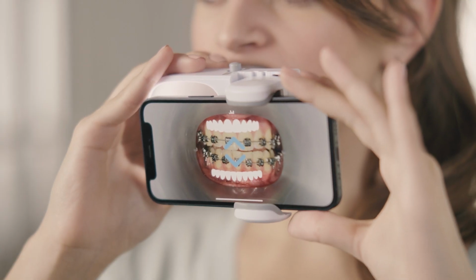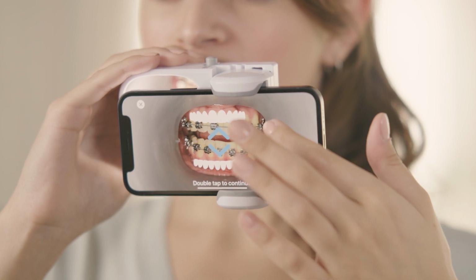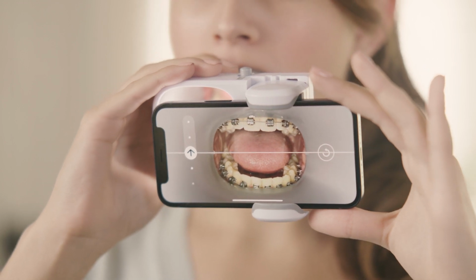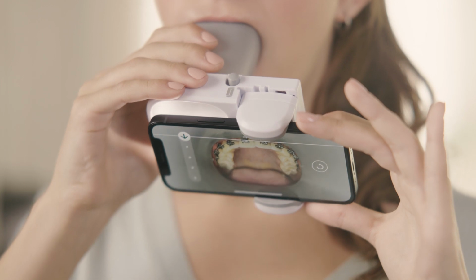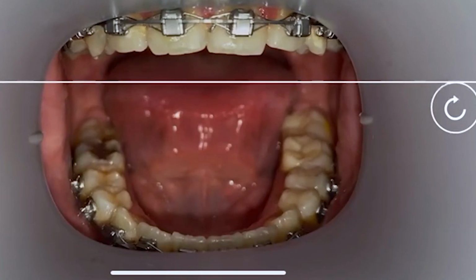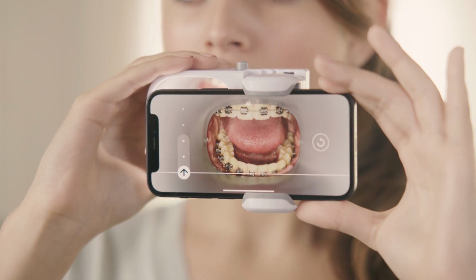For this next step, you'll have to open wide and scan up and down. Double tap to continue. Tilt the scan box up. Tilt all the way up until you can see the whole biting surface of your teeth. You can also tilt your head slightly in the opposite direction if that is easier. Now tilt the scan box down. Back to the front.